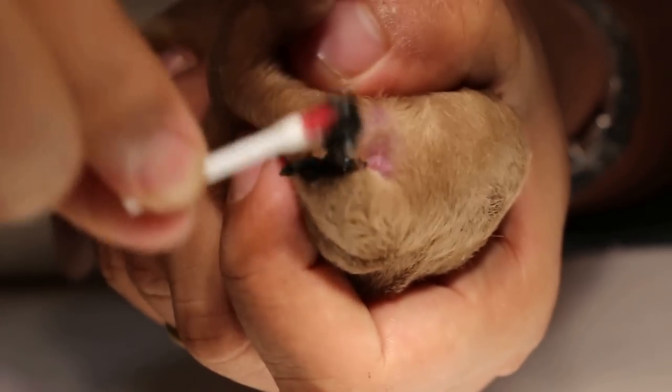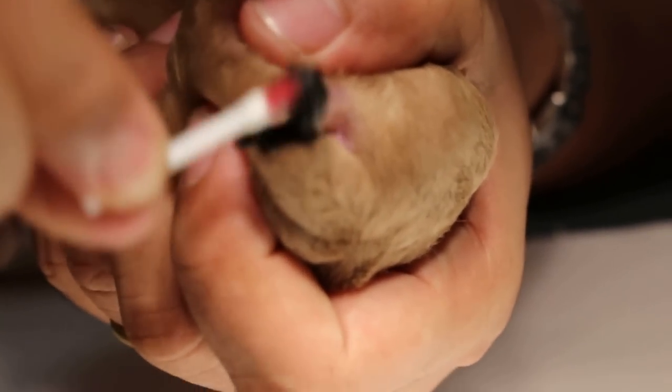Okay, don't put it down — we will do the second one. The same thing again. A good assistant has to hold the tail straight and then put the tail up. Hold it straight.